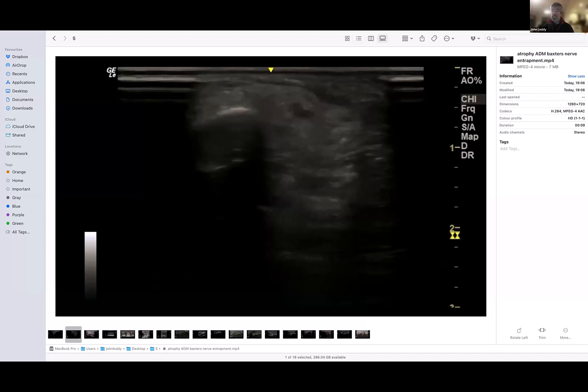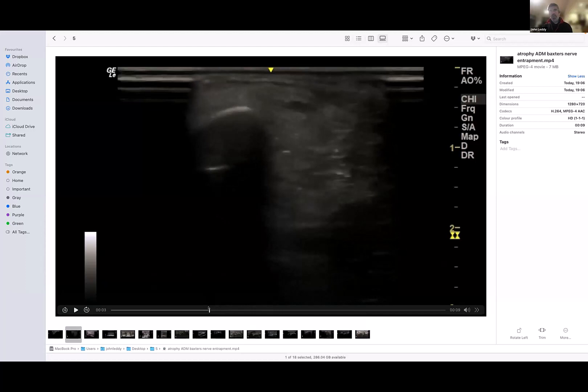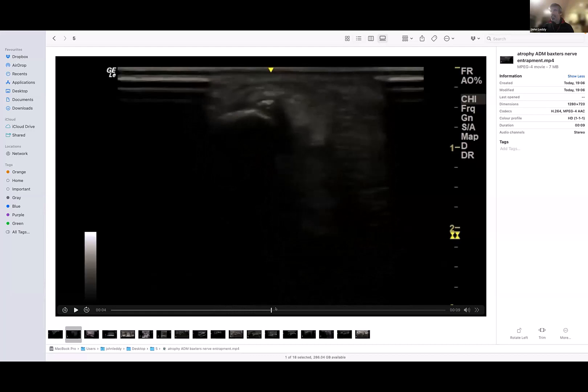Because that nerve goes all the way across the foot and supplies the abductor digiti minimi — and sometimes the quadratus muscle in the foot — in this patient, both of those were atrophied. No sensory change? It probably has some sensory branch but I'm not quite sure. Anyway, the patient had had plantar fasciitis pain for ages but turned up because of the lump.